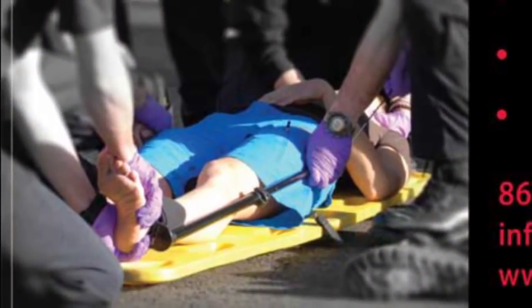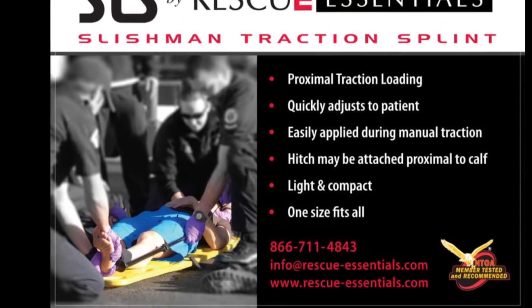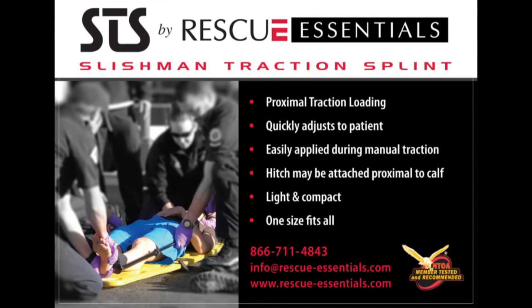The simplicity, versatility, and effectiveness of the Slishman Traction Splint is unrivaled by any other device on the market, making the STS a runaway best choice for EMS, tactical, and combat applications.